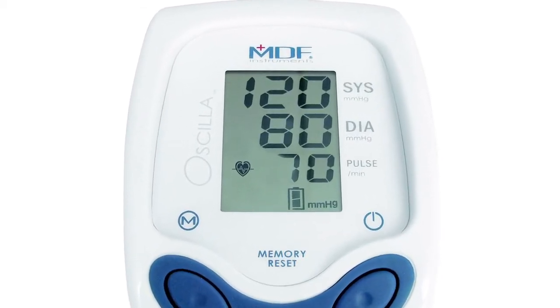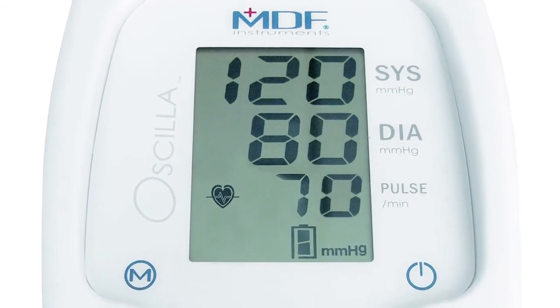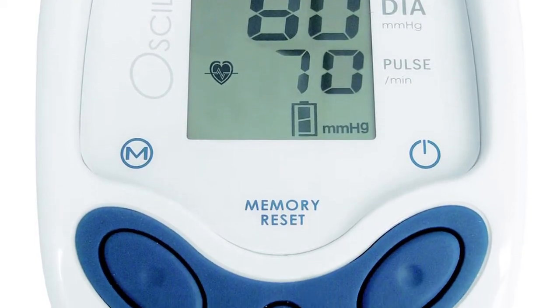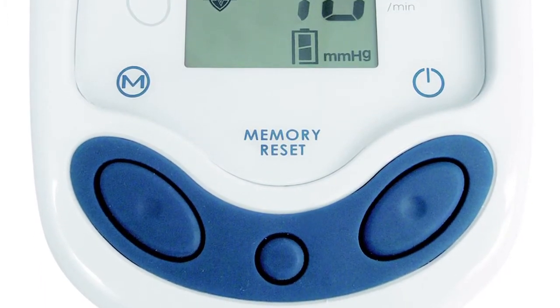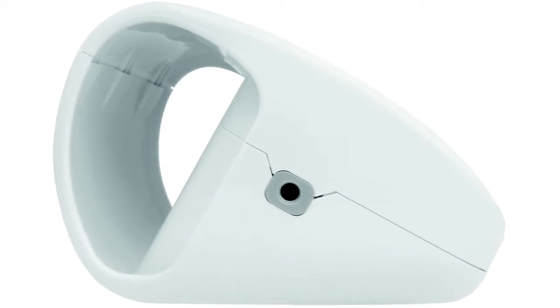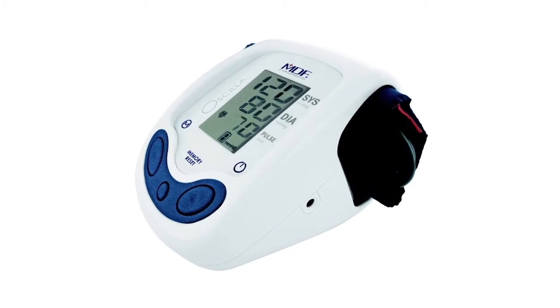Then we added a couple of practical and aesthetic features as well. First, we made the LED display larger and easier to read. Second, we simplified the operation so that you can just take it out of the box, insert the batteries, and press start. Finally, in designing the housing, we added a functional storage compartment to hold the cuff in a way that adds to the modern and sleek design while leaving a small footprint on your office desk.